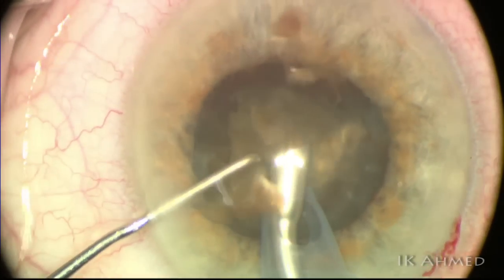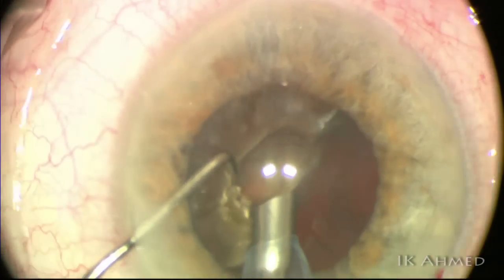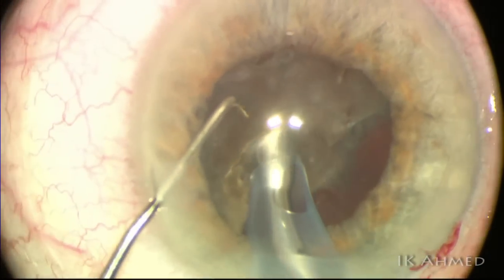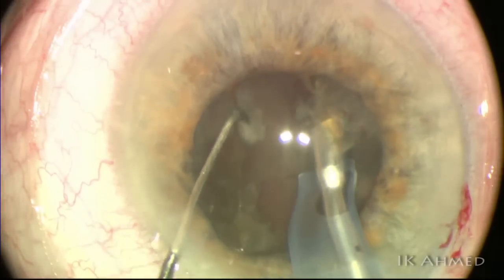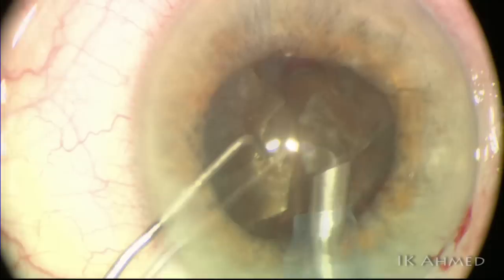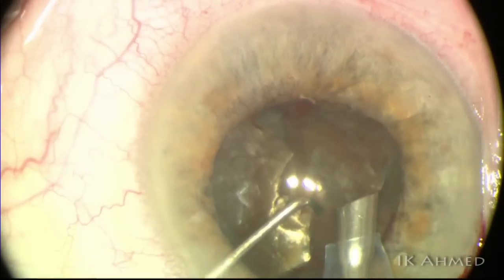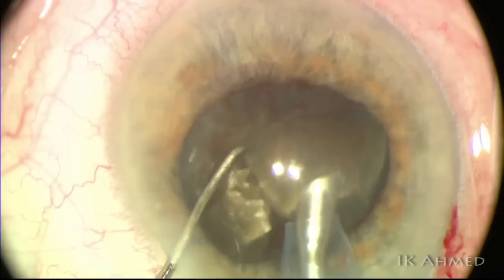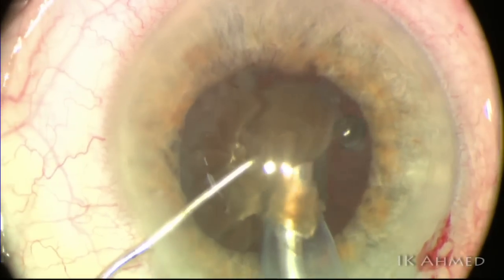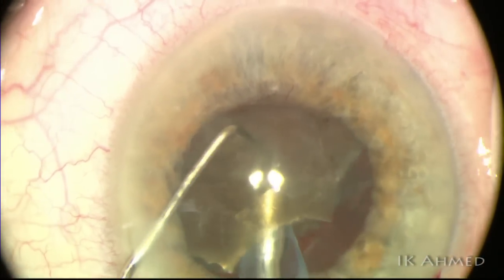Carouseling the nucleus around the tip helps to prevent chatter. We've got half the lens out now and can visualize some red reflex, which is helpful. We turn the bevel of the phaco tip to oppose the shelf of the hemi-nucleus to get a good purchase. We inject a little more dispersive viscoelastic to protect the endothelium — these are longer cases with more phaco time, turbulence, and power. We continue chipping away, carouseling pieces with the chopper and using the right phaco pedal modulation to apply the right amount of energy.